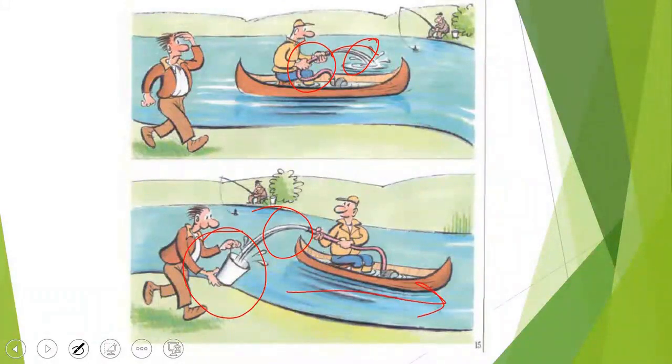This is why I create excitation, or change its orientation, by altering the direction of the protons to generate a magnetic field in another direction. This allows me to take measurements and see how high its peak is.